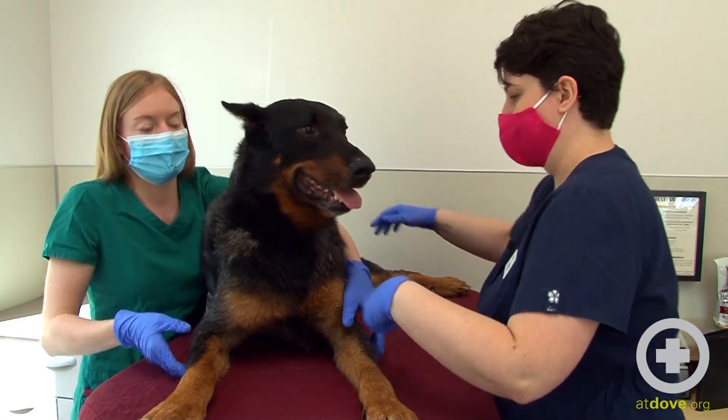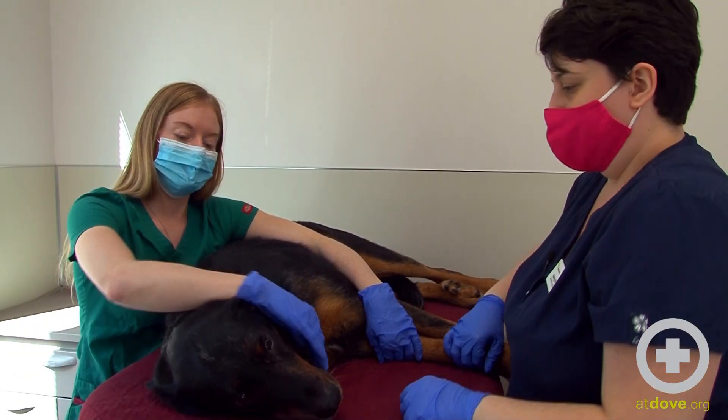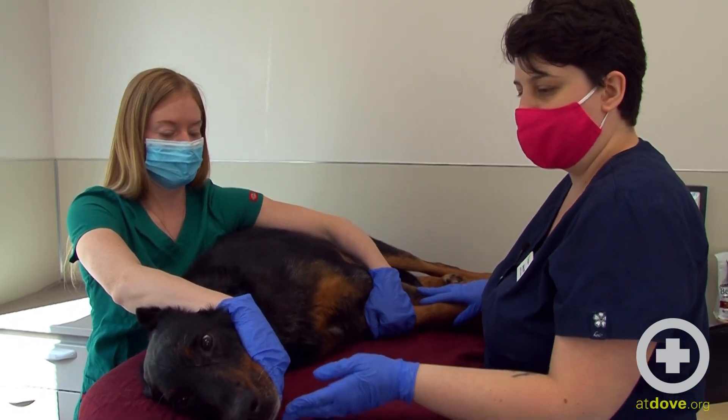We're going to lay him on his side. Good boy. A restrainer, Megan, is going to just pull his front legs back and extend his neck.